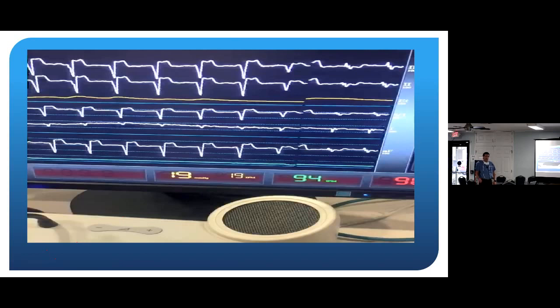And don't make me lie and try to remember pathophysiology from med school, because I have to fake it, and I got colleagues here that probably know it better than me. But in short, when that is occluded, you can see that ST go up, right? The heart's being damaged, ischemic, hurting. They put that balloon up, blood flow goes through, EKG looks better. So it's pretty cool.